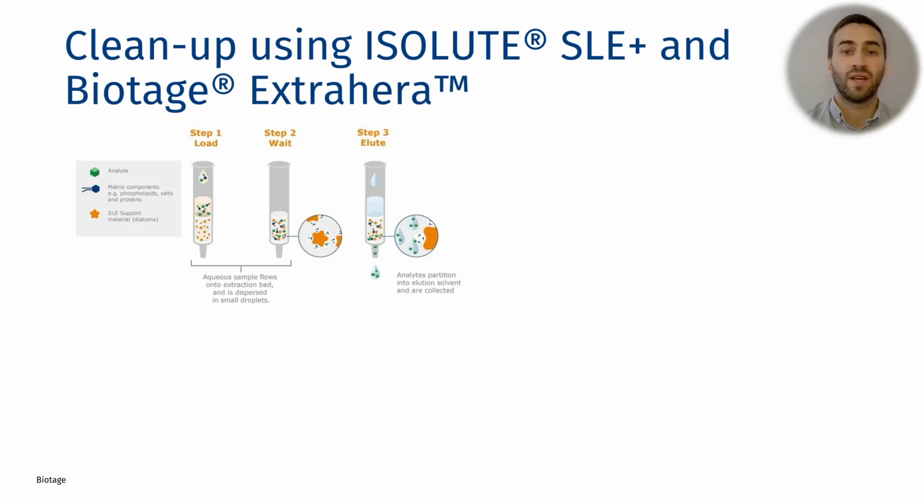We cleaned up using Isolute SLE+, and this was automated on a Biotage Extrahera. SLE is analogous to liquid-liquid extraction, in which the extraction is based upon the partitioning of the DoA and the THC panels from an aqueous sample into a water-immiscible elution solvent.